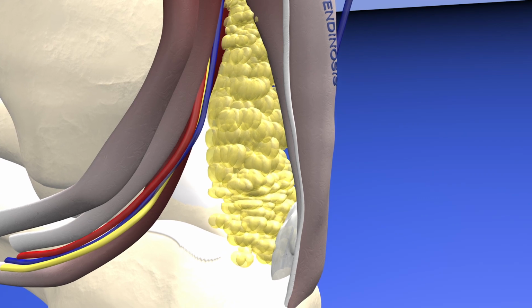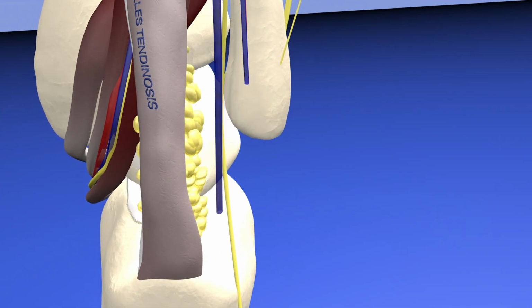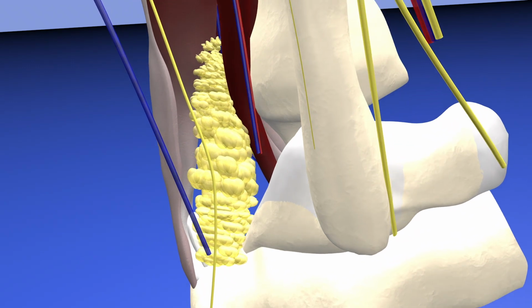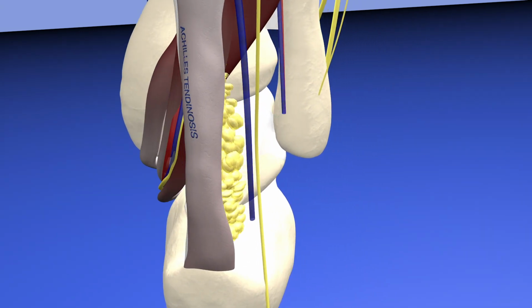Here is this tendinotic tendon. You can see that it's somewhat bulbous in shape in the distal aspect of the Achilles tendon. The actual insertion is fairly normal in thickness, but as you go somewhat proximal, you can see this thickened bulbous Achilles tendon, which is labeled accordingly.